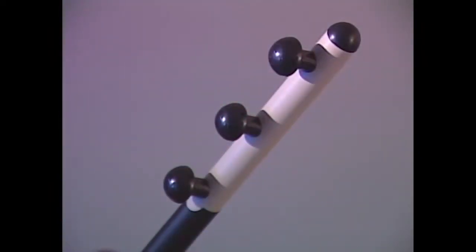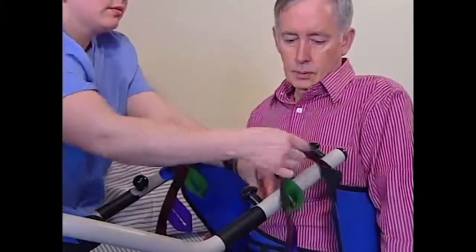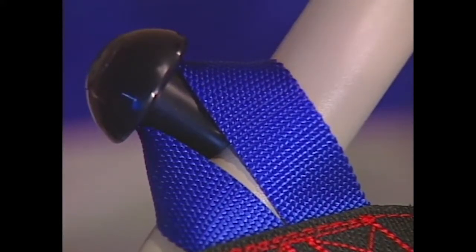Select the appropriate attachment point according to the resident's height. This resident is 5 feet 9 inches, so the medium attachment points are used. Attach the straps from outside the lift arm, and use the same color straps for both arms.